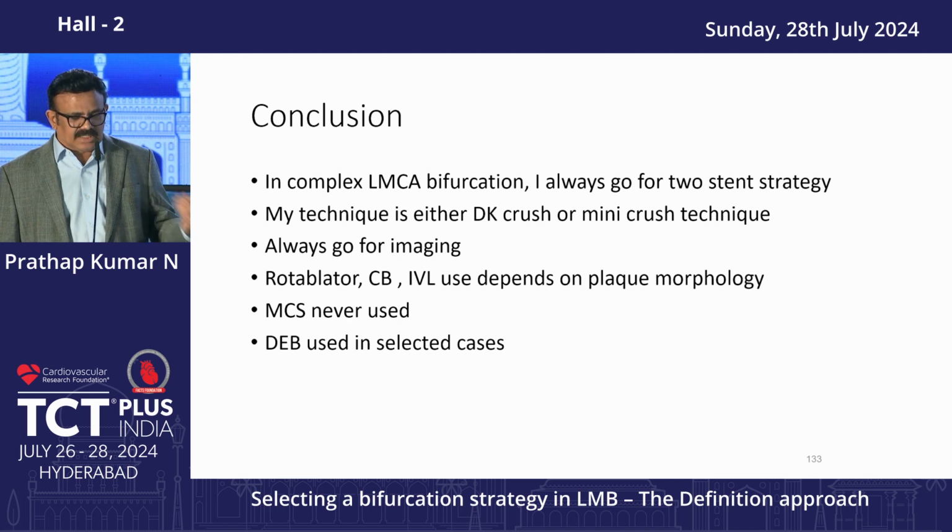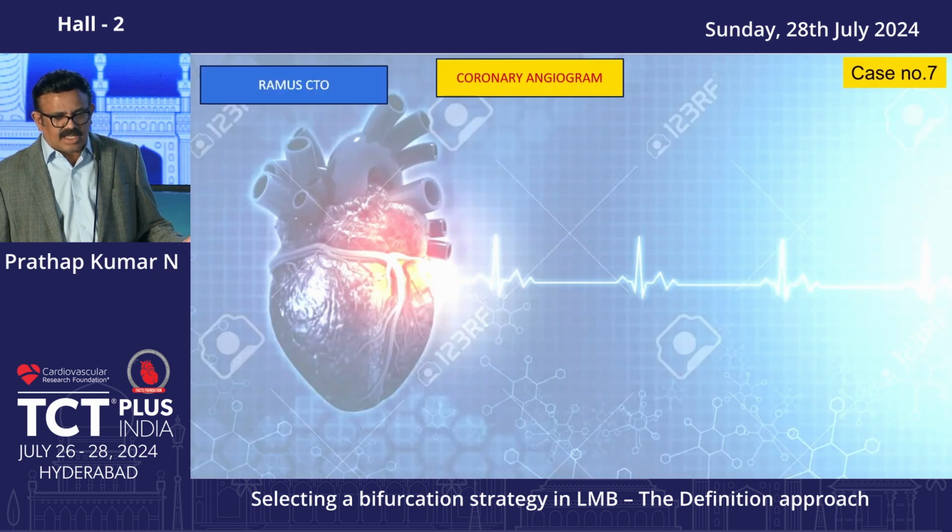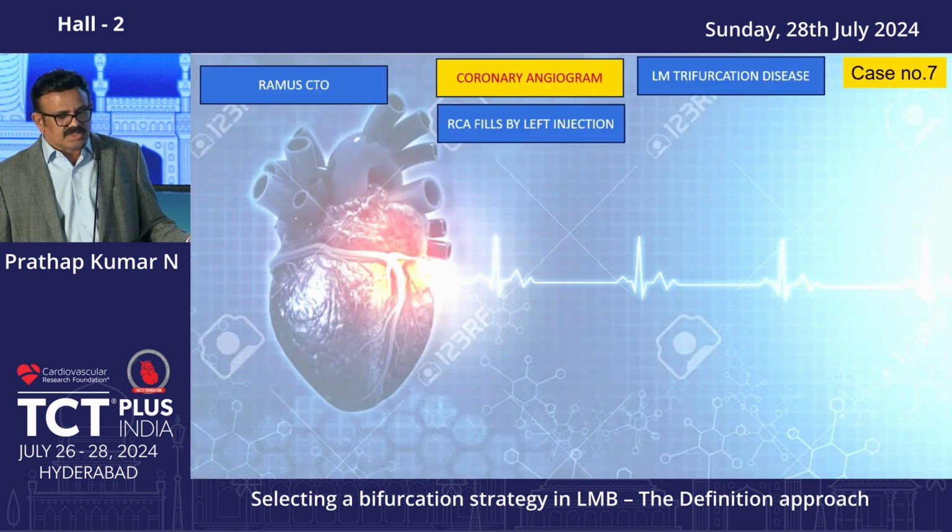My technique is a DK crush or mini crush. Always go for imaging. Rotablation, cutting balloon, IVL depends upon the plaque morphology. MCS never used. DCB is used in selected cases. This case you just see. Ramus CTO, RCA.